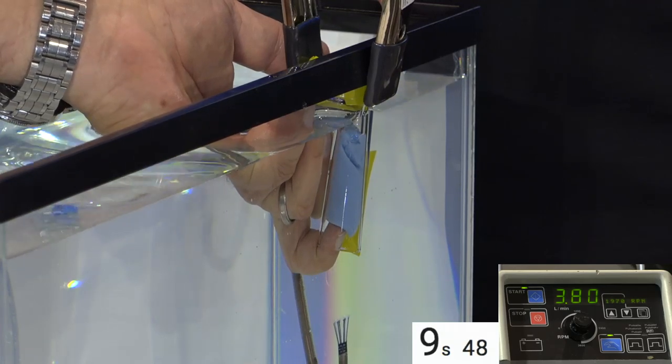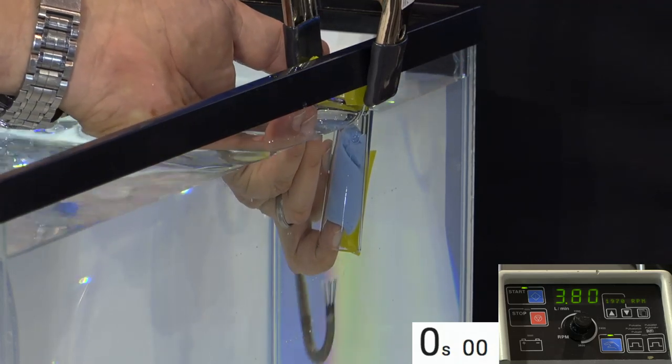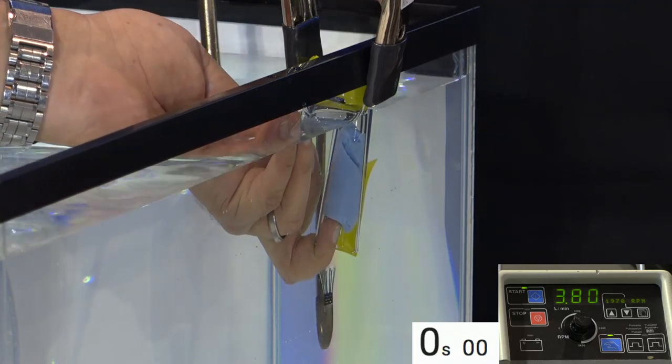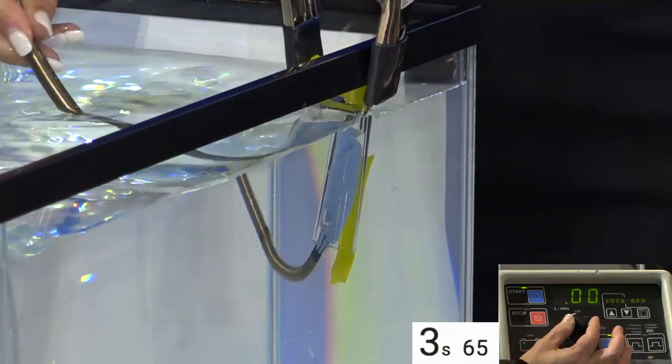You might as well bump that flow rate up a little bit. No, don't start the clock. We're not ready. You got to go up and get it. Can I have 4.5 liters of flow? I'm waiting. Can I have 4.5 liters of flow for you? Oh, you got my finger. 4.5. Go get it. Okay, start the clock.